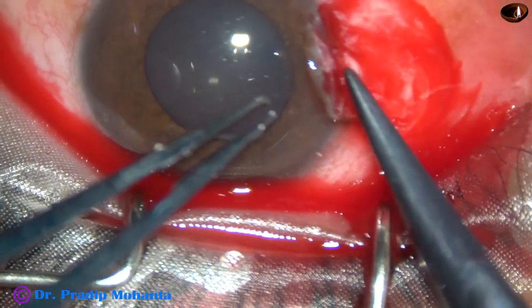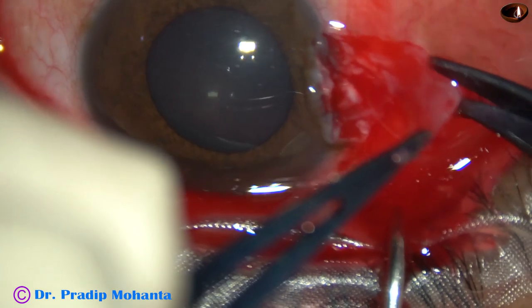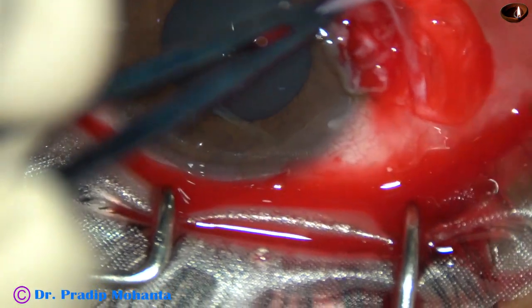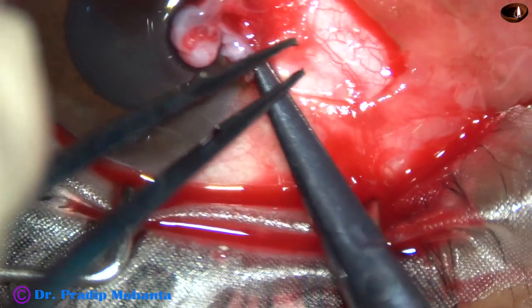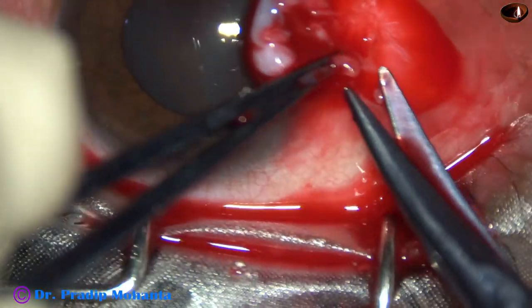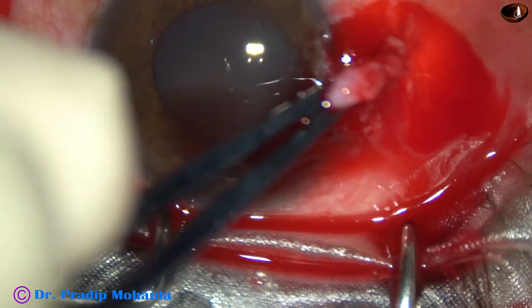First, let me remove the subconjunctival tenons. This tenons tissue is the culprit. The conjunctiva is benign, and this tenons grows onto the cornea and pulls the conjunctiva along with it. So this tenons should be trimmed as much as possible.